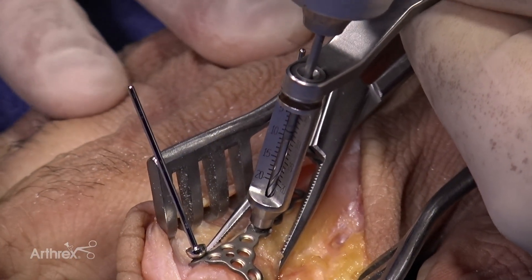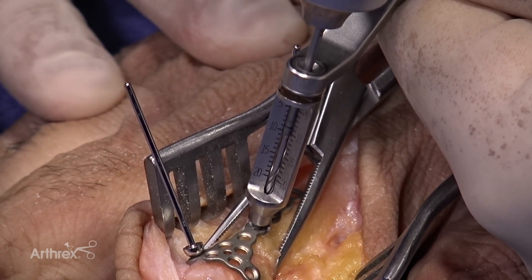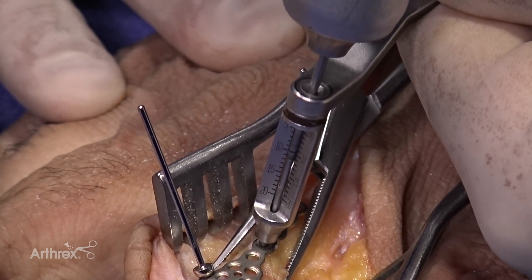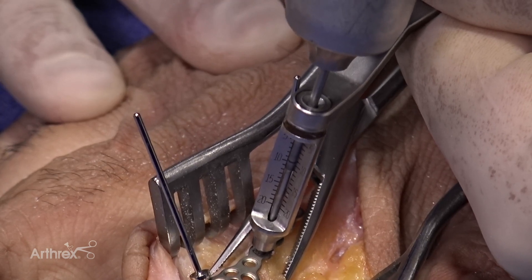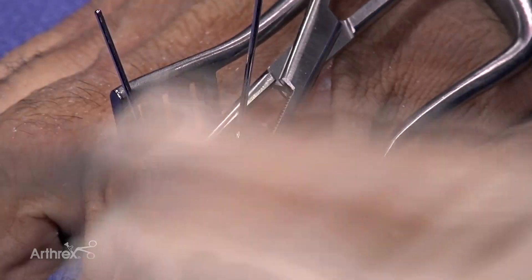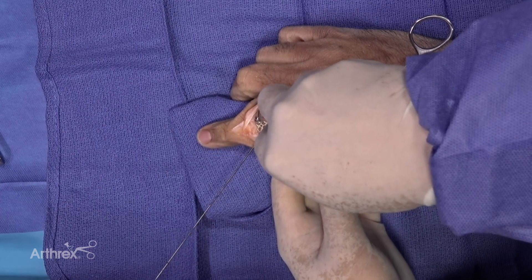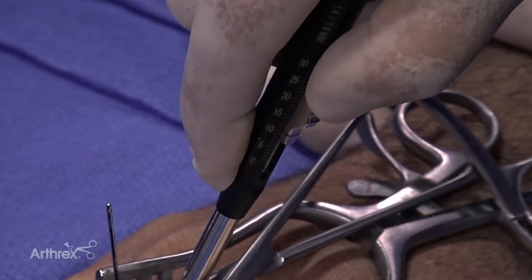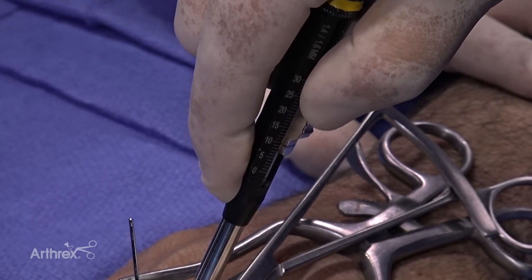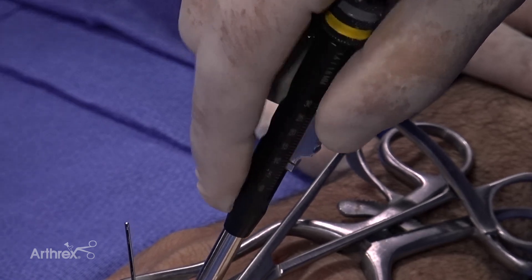At this point I've gone through the first cortex and I'm up against the second cortex. I can clearly see that my laser line is at about eight millimeters. I'll go ahead and come through the second cortex. If I measured eight at that cortex, I'm okay putting in a 10 millimeter screw. The depth gauge confirms my measurement is around nine or ten millimeters, which corresponds with what we measured directly off the drill guide.